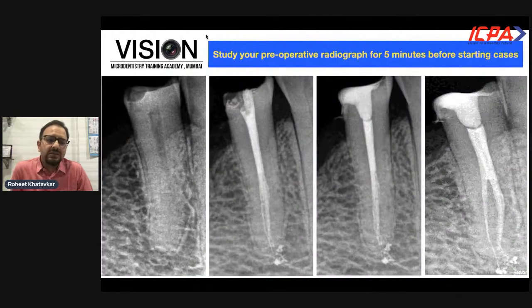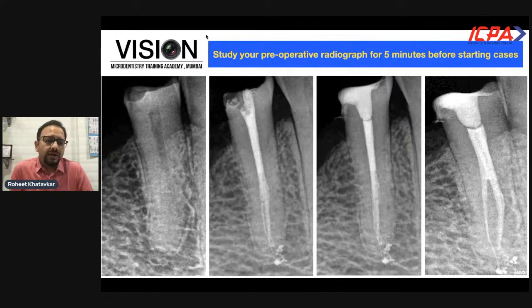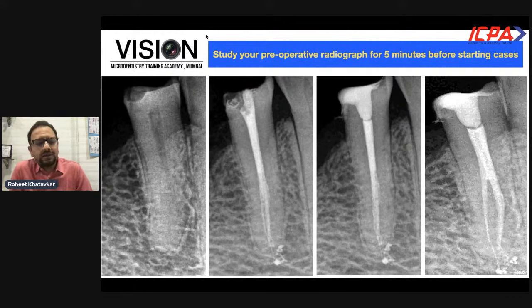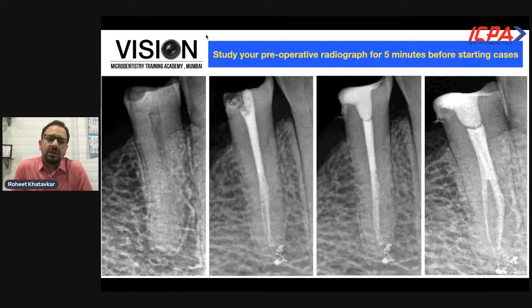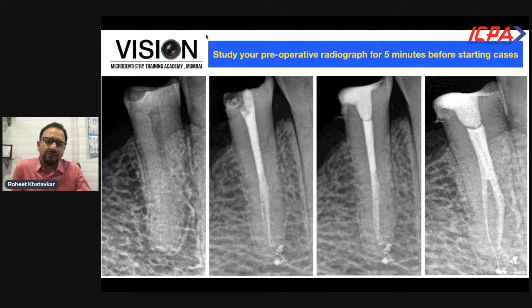Sometimes even the simplest of cases can turn out to be difficult. Like this premolar — if you had not studied this radiograph properly and started an access cavity presuming there was only one canal, you would have ended up missing an entire canal. That is why it is important to take your time and study the radiographs before starting your access cavity.